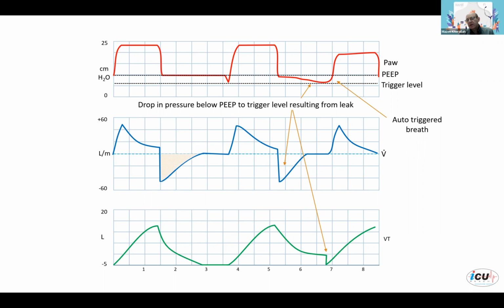What I would do is, with a protective lung strategy, you have 4 to 6 ml per kg. You can go up to 7 ml per kg, but I would try to stay within this limit. If I can keep the total volume, including the leak volume, less than 7 ml per kg, that would be preferred, because I cannot estimate exactly what the effect of the tidal volume is on the other alveoli before it leaks.